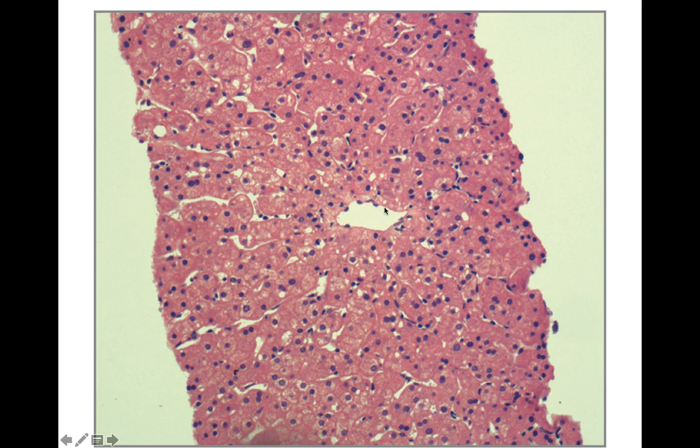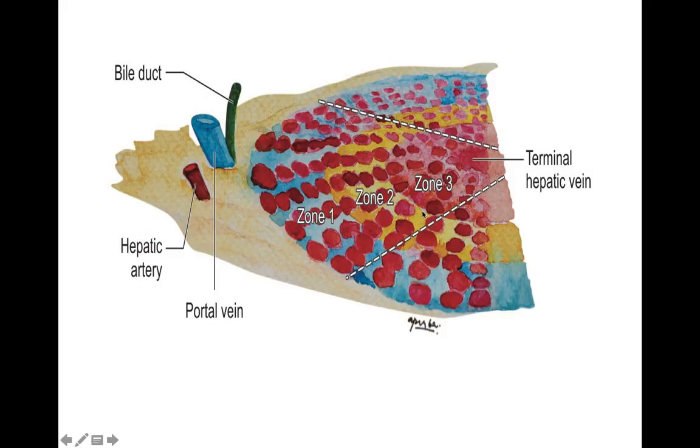Now as we saw in the first slide also, there is very little connective tissue abutting the central vein, and the hepatocytes just come and sit on the central vein. So that is how you differentiate the central vein from the tract, and you do not see any artery or duct over here. The hepatocytes just emanate from it and are arranged in a single cell plate architecture, especially in the adult. Now this is a pictogram which is showing the different zones of the liver.